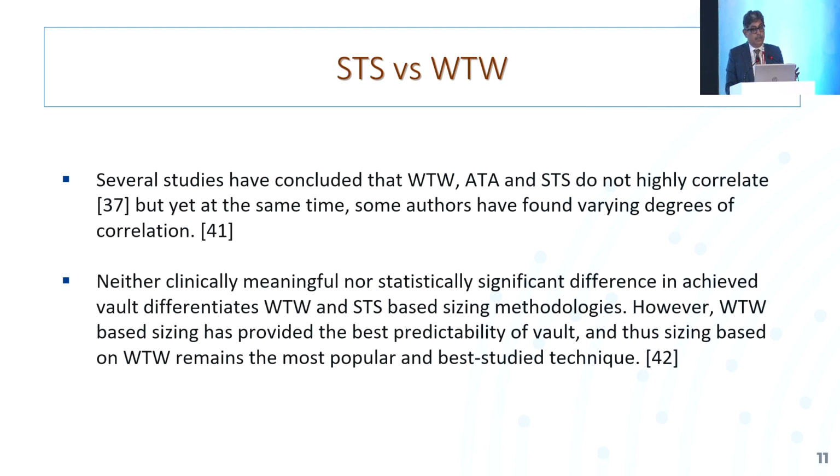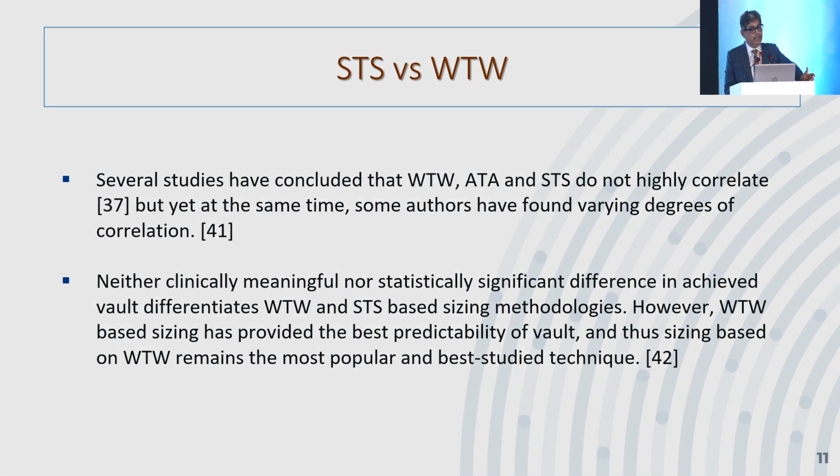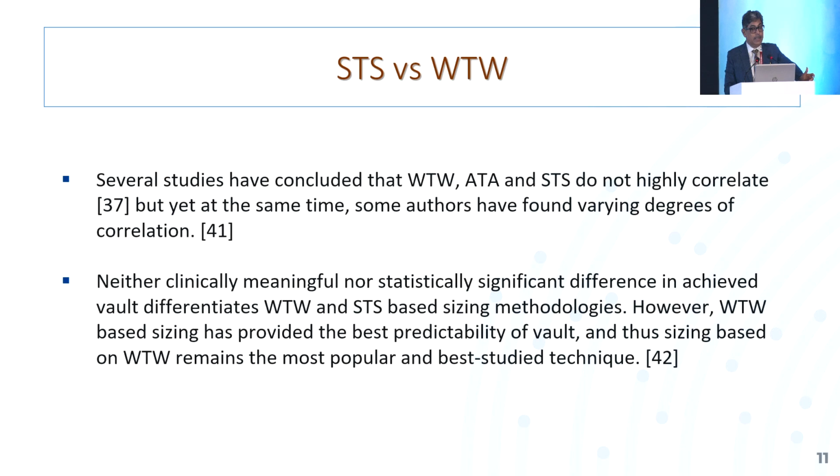Coming to the sulcus to sulcus measurement of white to white, there are various studies which say that there is no correlation between them, but some correlation has been postulated by some studies. It requires UBM to measure the sulcus to sulcus.